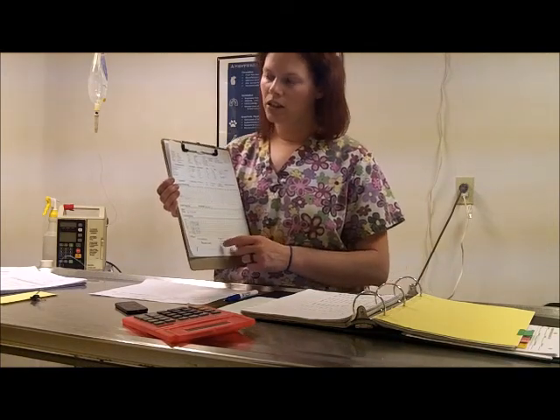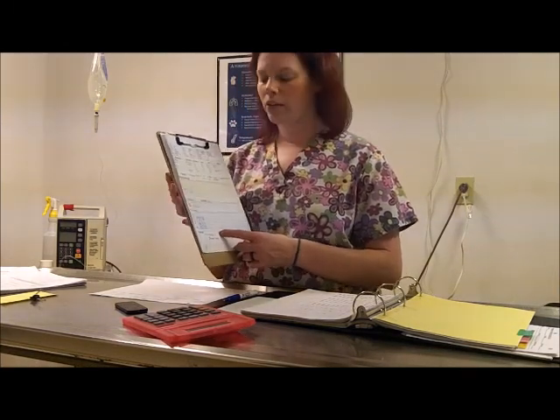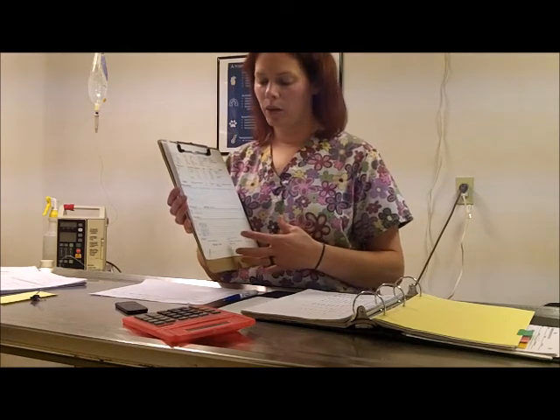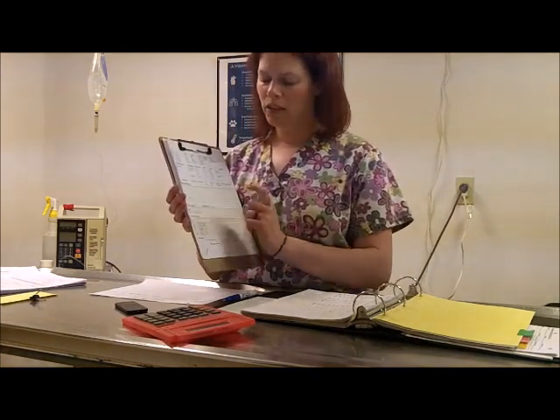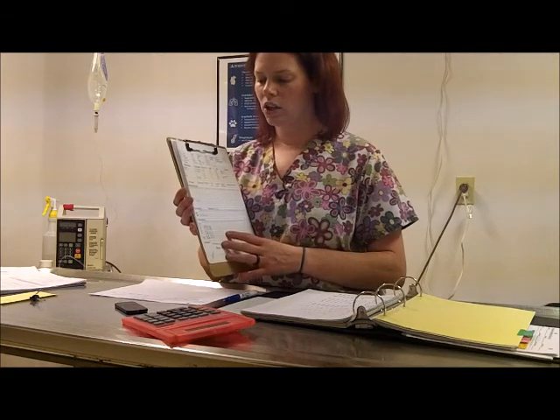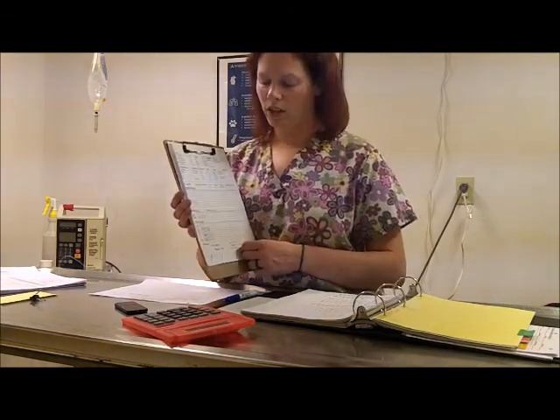The bottom part here is our vital monitoring. So every 5 minutes when we're taking our vitals, considering our pulse ox, our heart rate, respiratory rate, CO2 production, capillary refill time, and blood pressure, and temperature as well. Again, this is mainly for seeing how our patient is handling anesthesia, following any trends that can help us determine whether or not we need to adjust our vaporizer settings, adjust our fluid rates, and that kind of thing.